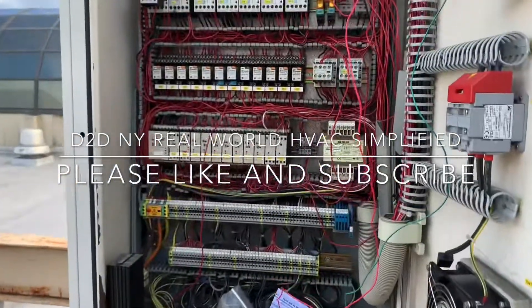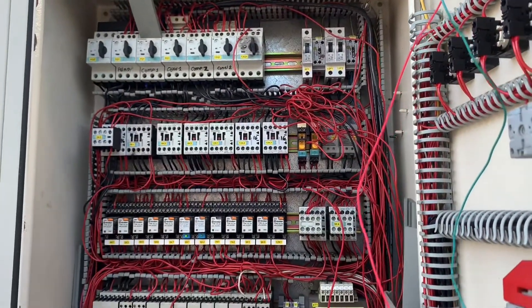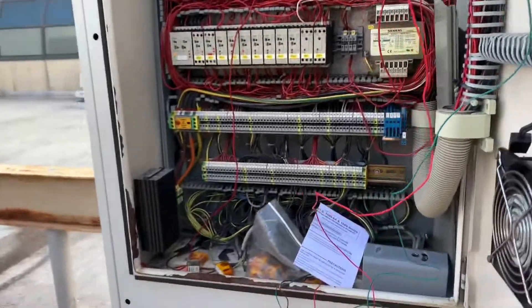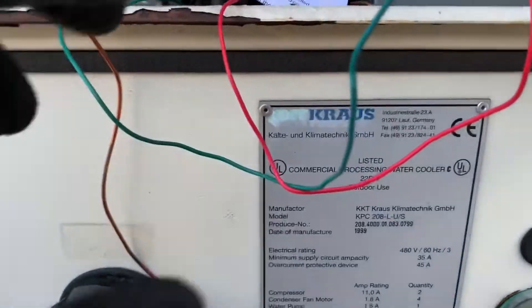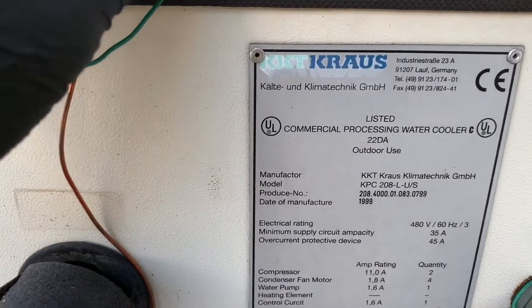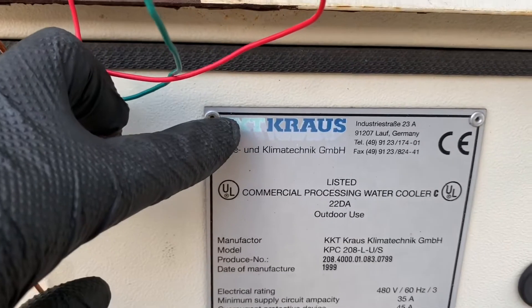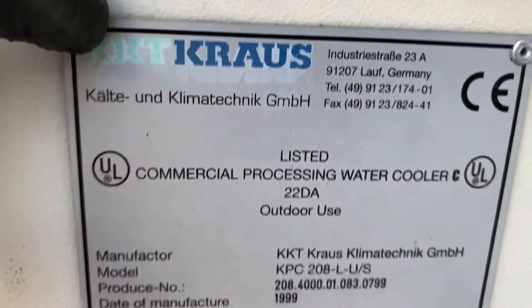D2DNY, real-world HVAC simplified. Today I'm going to show you another HVAC hack. I'm going to show you how to hack this chiller — this is a chiller used for medical use and it's called KKT Kraus, made in Germany.